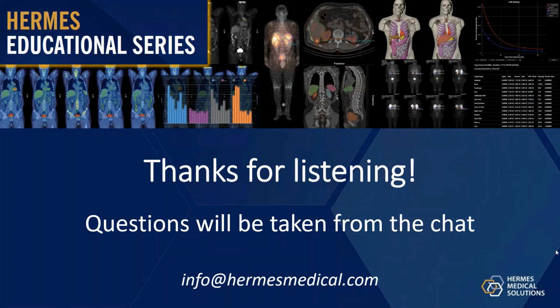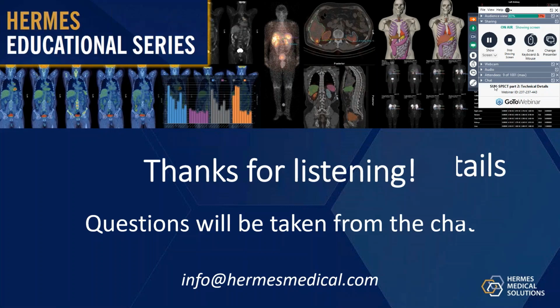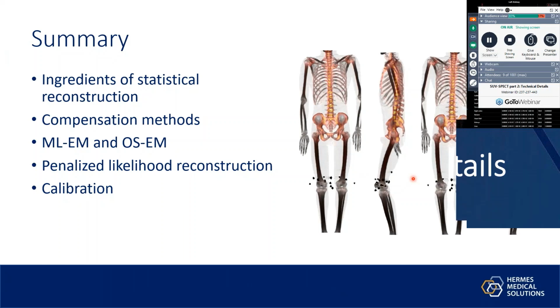I think that Layla might have got those factors from the slide that you showed, with the work done in the Michigan site, I think, where they looked at using different numbers of voxels to make the calibration. And I think your slide there was just demonstrating how much effect that can have if you don't go with the recommended cylinder method.